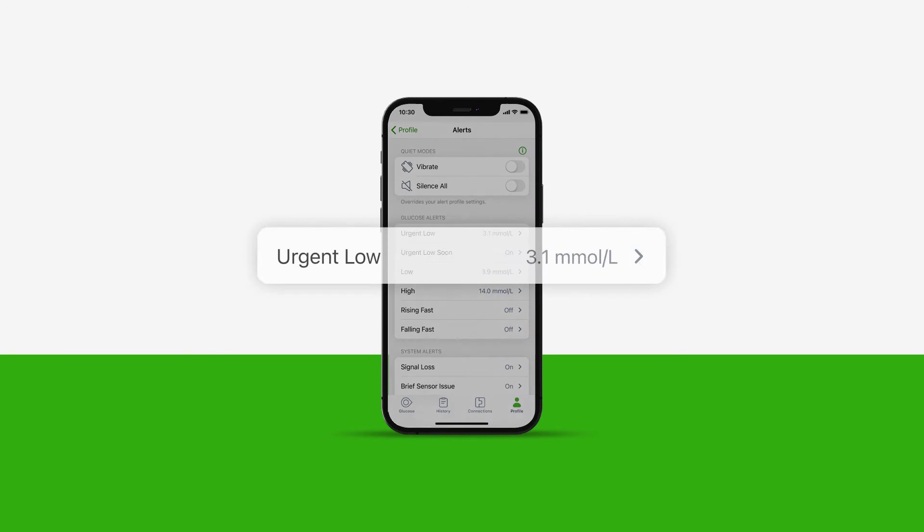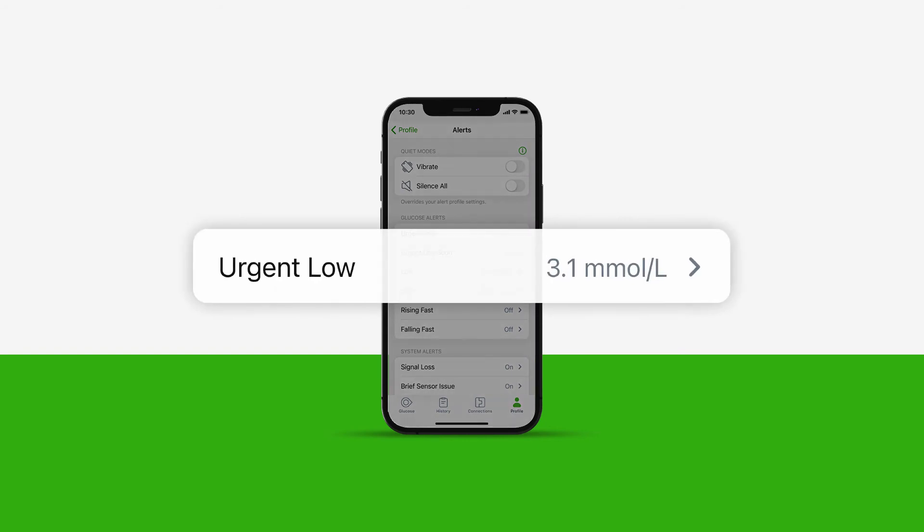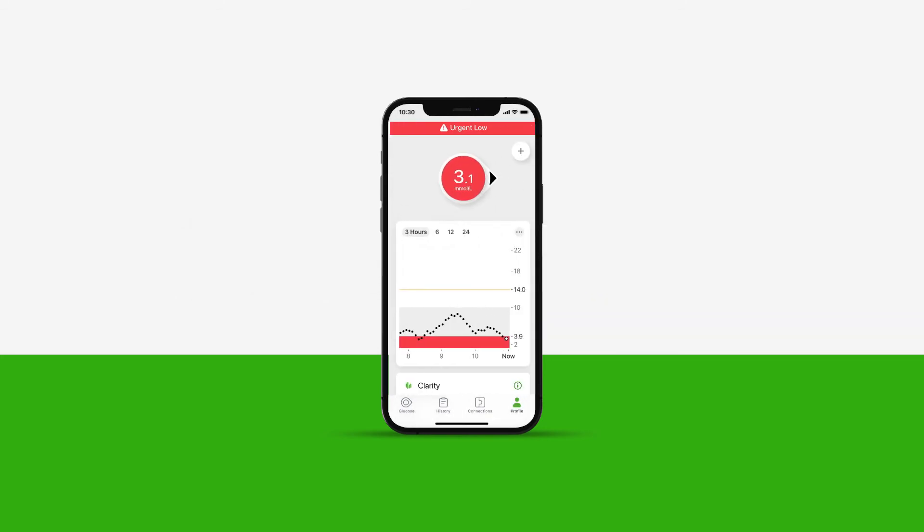Now let's look at the urgent low alert. This alert is fixed and will alert you when your sensor reading is at 3.1 mmol per litre or below. In the menu, you can customize the alert notification.